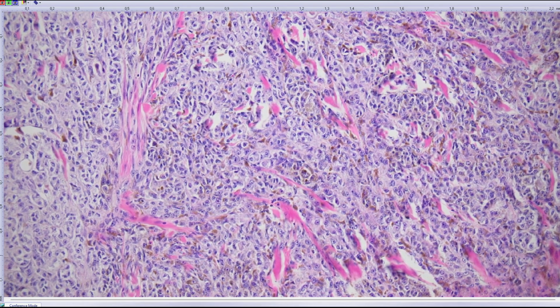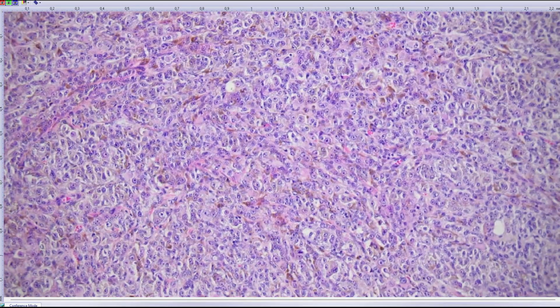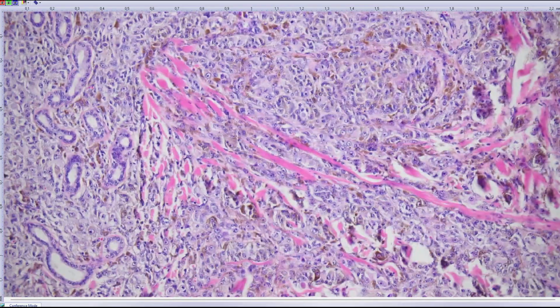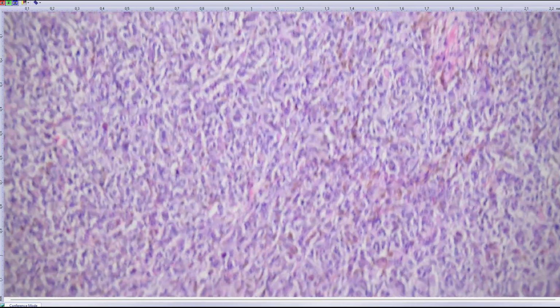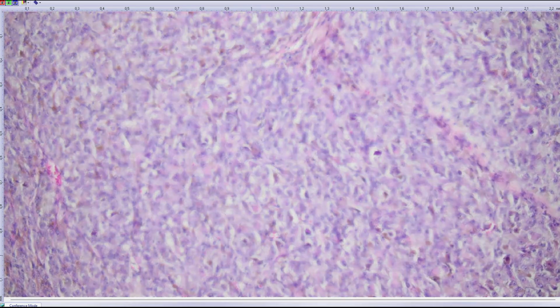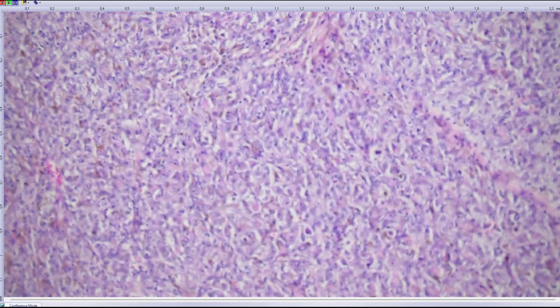No, I don't really. Some residual cellular blue nevus was seen. In this place, you see just this pleomorphic pigmented lesion. And sometimes you can see quite well differentiated cellular nevus with some atypia, and you cannot say whether it is malignant or not. It's difficult to solve if it does not have a third mutation. Those having third mutations are usually diagnosed later as malignant melanomas.